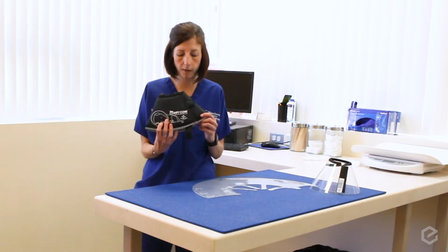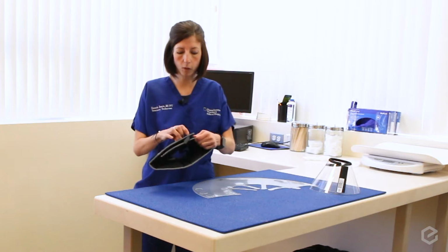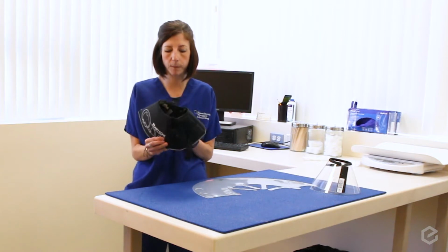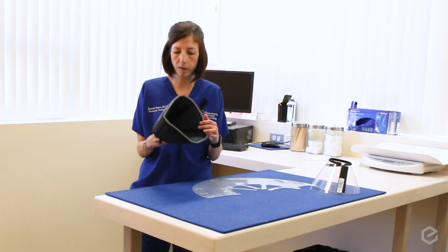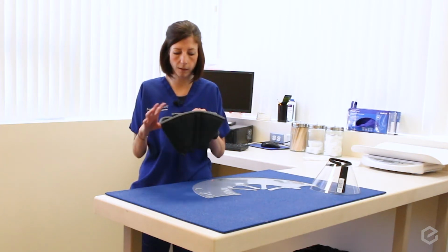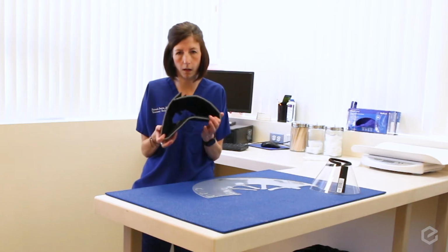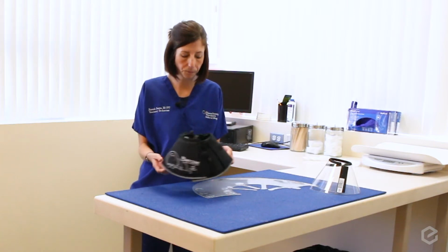So they have the Comfy Cone, which is a soft padded e-collar that velcros together and has different sizes that you can make the headspace to fit on different size patients. Most of the time they do really well with this collar. The only downside, it is not clear so they can't see from side to side, but it's a lot softer and comfier than the typical plastic collars that you get in your practice.